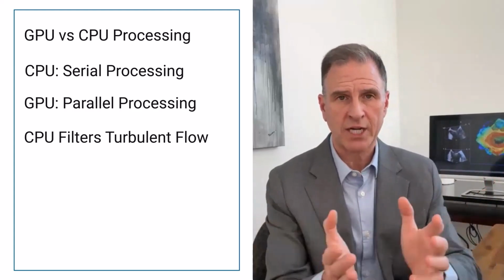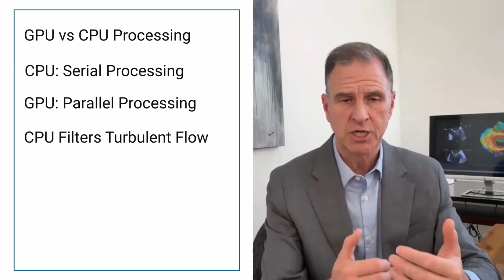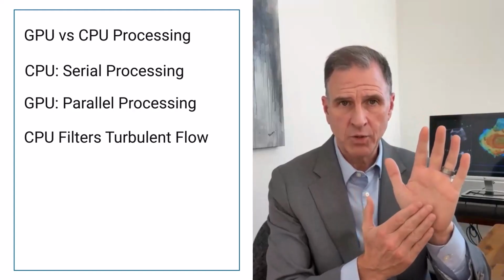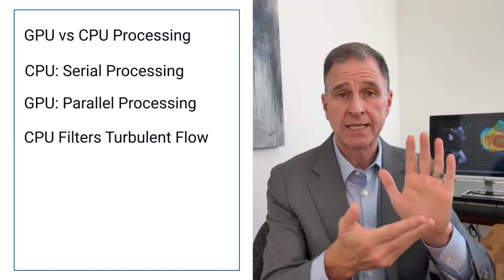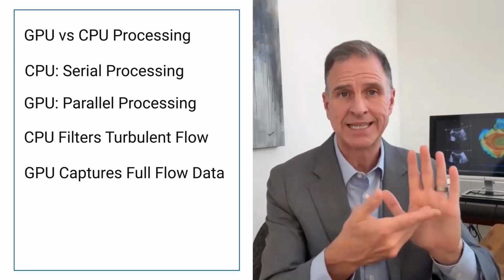Essentially, they're doing a regression toward the mean to present, through the CPU calculation, a high confidence set of data. By doing so, they're very confident that the data presented is at least this. Now, it could be higher, but it's at least this.